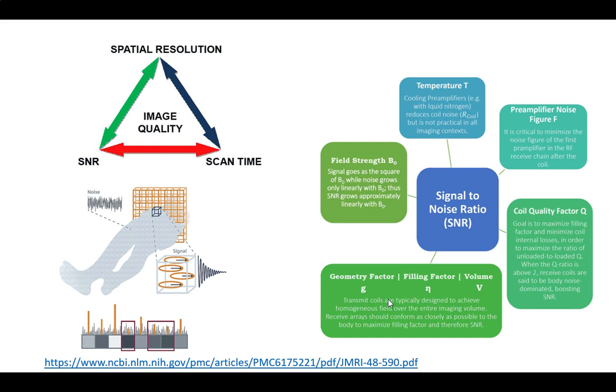this is something when you look at your circuit that is going to amplify certain things. That's something you want, particularly with your system. You're going to pick some up. Coil quality factor: not all coils are created equal. Some of them have to do with the shape, some with the manufacturers, some with the material. There are a lot of different factors that go into this.